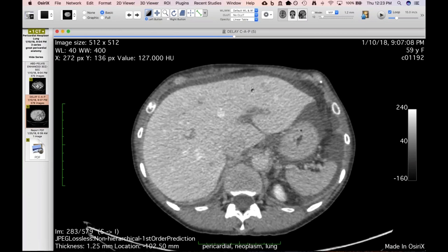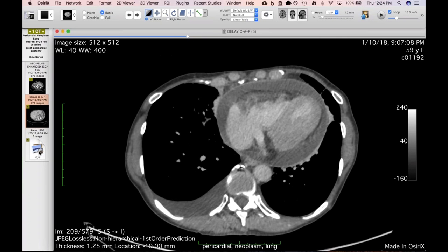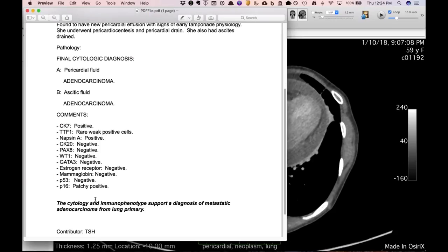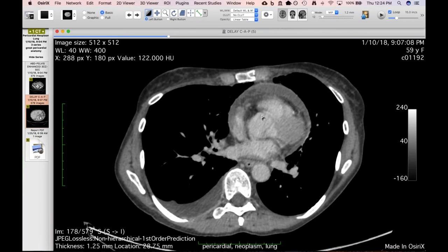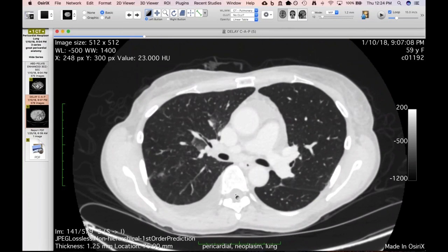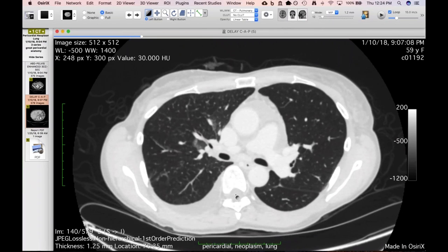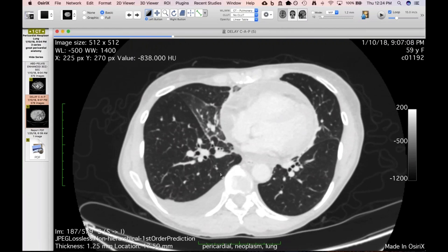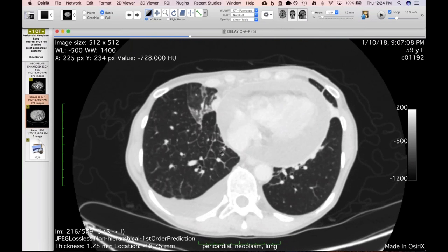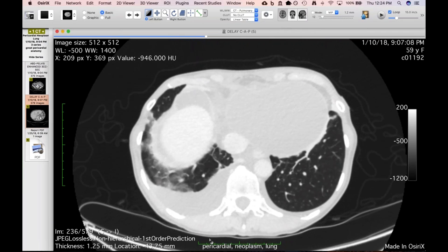They put a drain in and tapped the ascitic fluid as well. This came back surprisingly as metastatic lung adenocarcinoma on staining. I've never seen a malignant pericardial effusion give such smooth, apparently smooth thickening. What's more, she doesn't really have a primary tumor visible — just a little biapical scar.